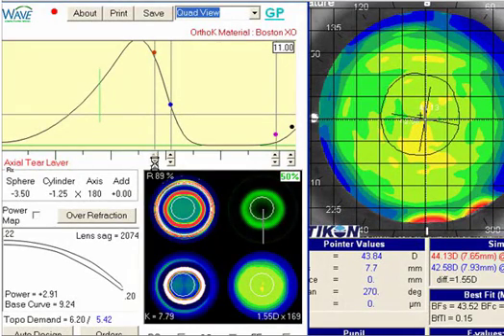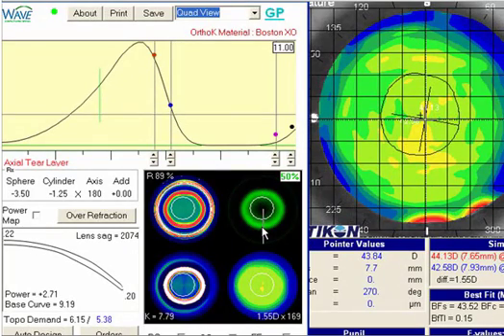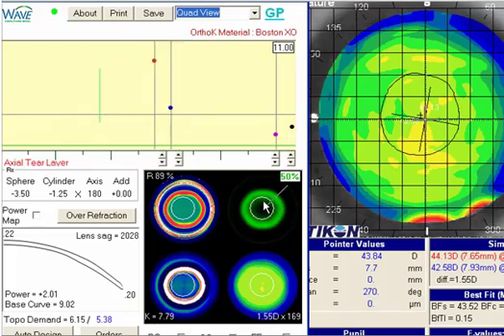So I'll click down under the red dot until we get to just about a 273, so 271. So that's going to be good. And now our power is adjusted. You'll notice we have across the horizontal a 146, 147, vertically 273, 271. We have our oval optic zone.